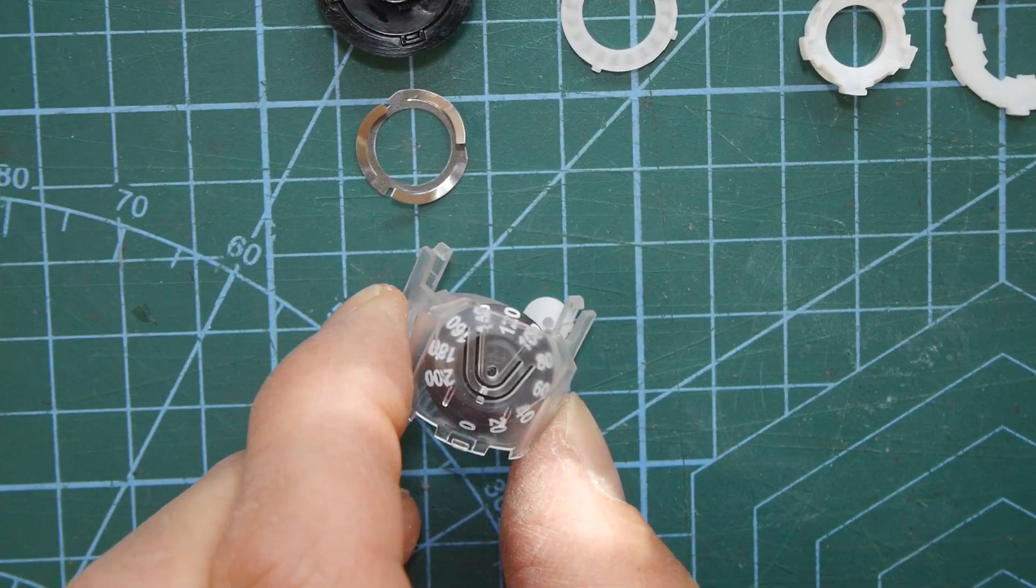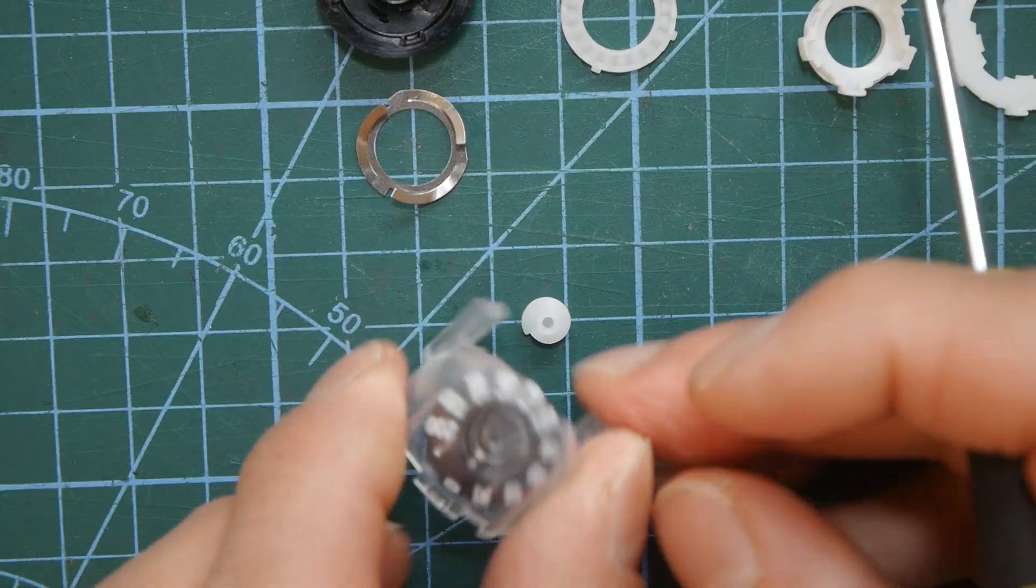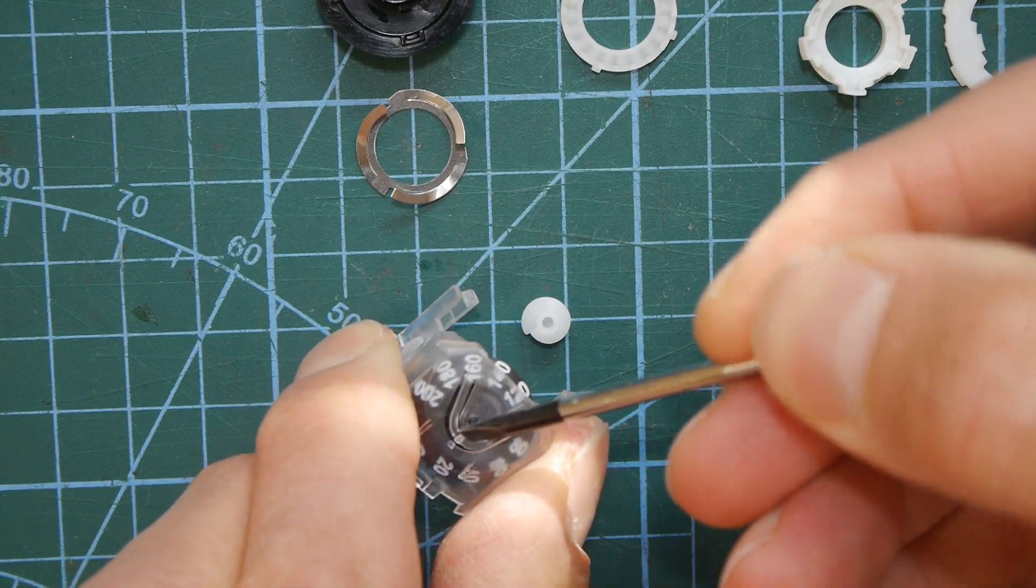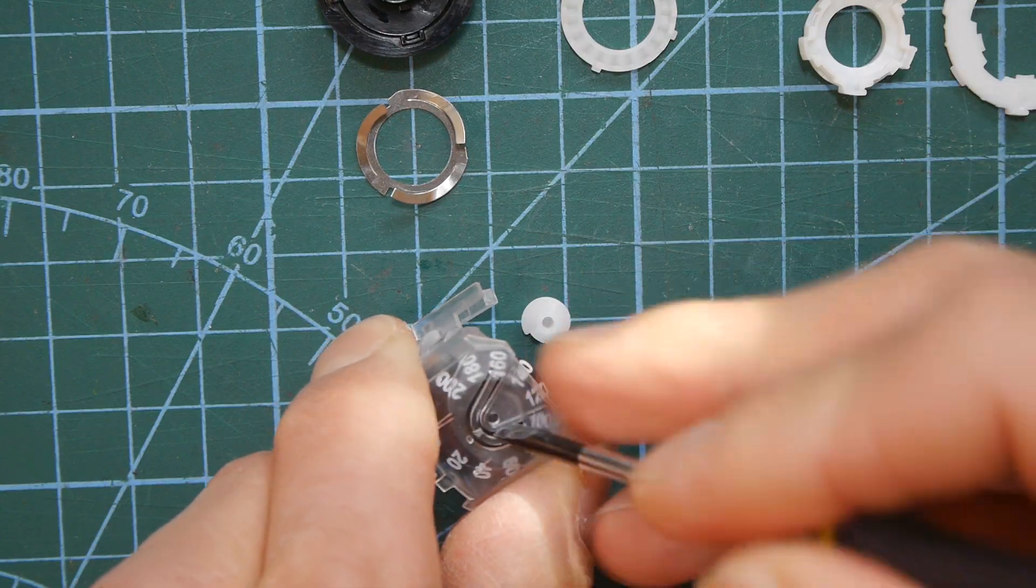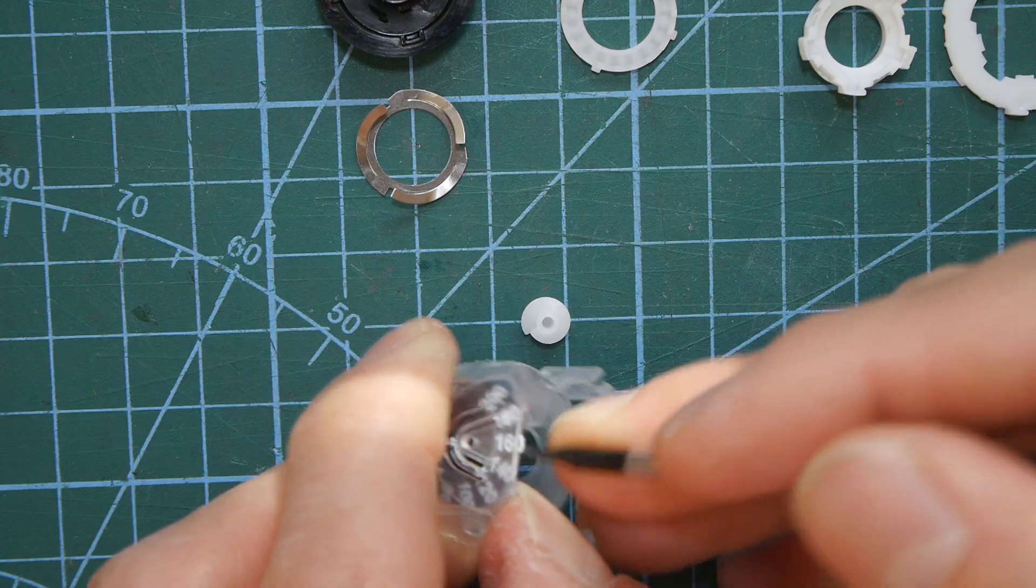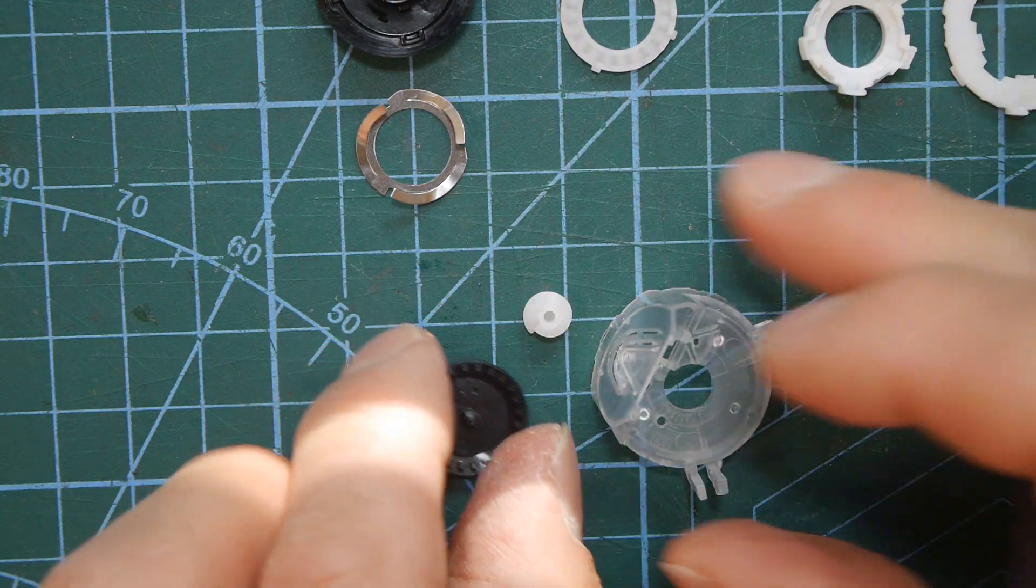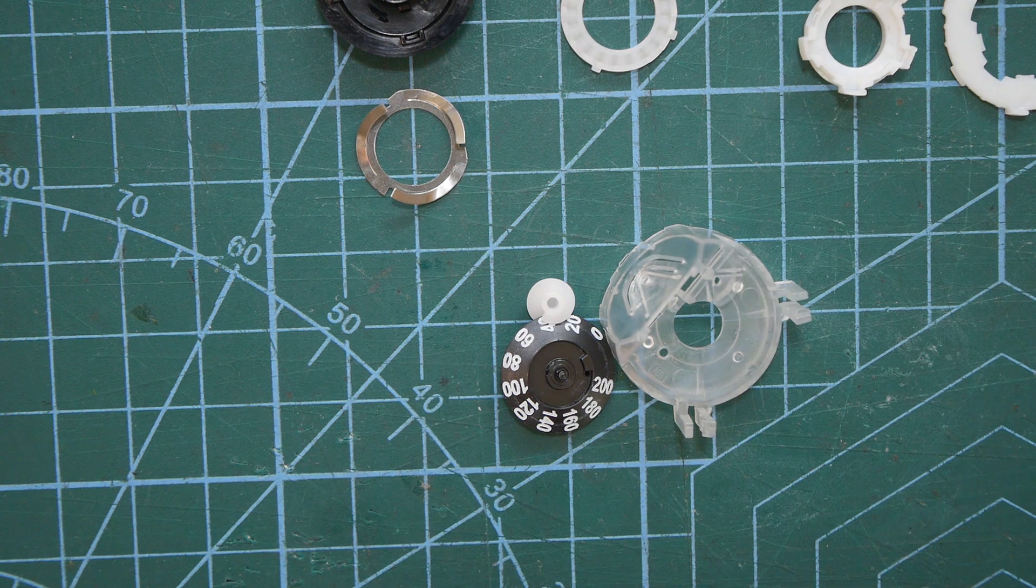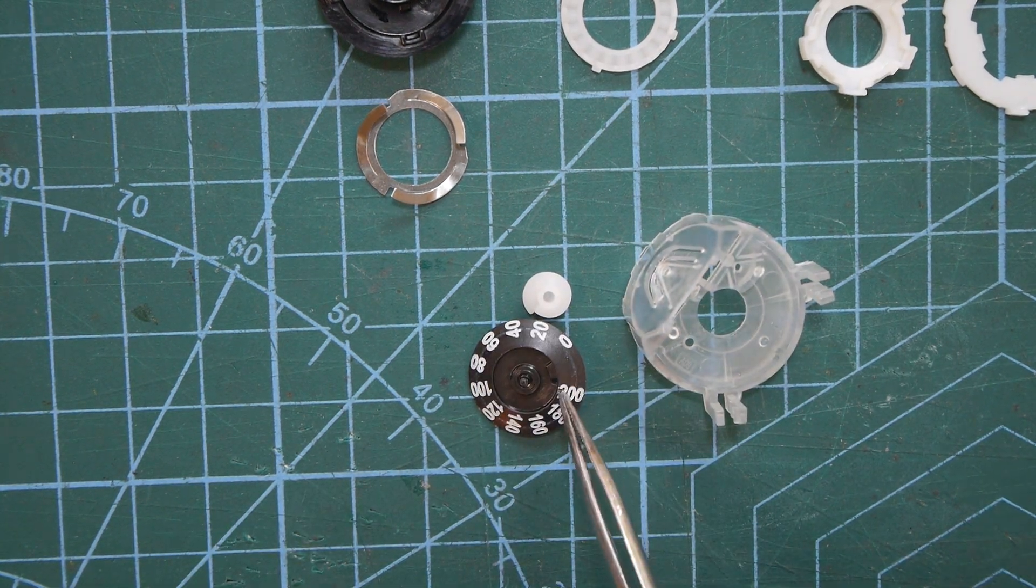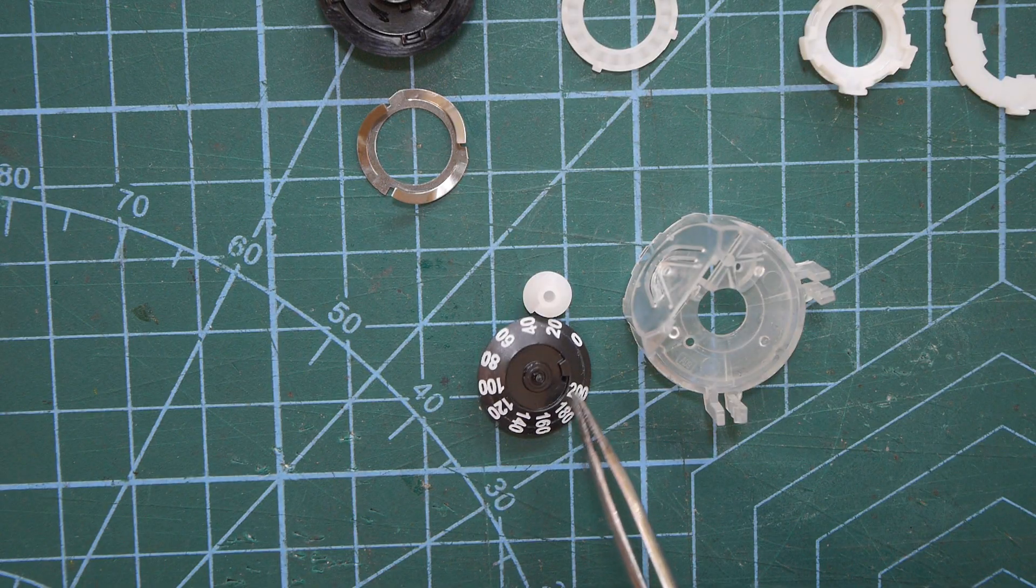So should we see if we can get the counter wheel out now and that's sort of easier said than done because it's sitting under that bit there. Very fiddly, oh there we go so that's come out and so you can see the numbers on the counter wheel.